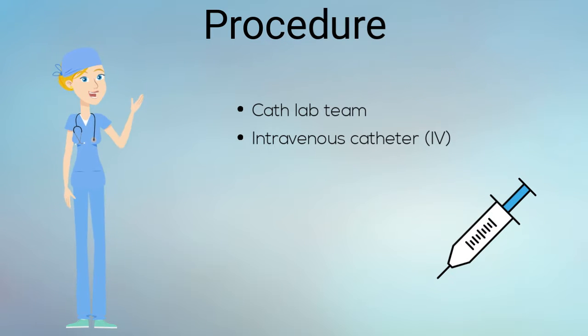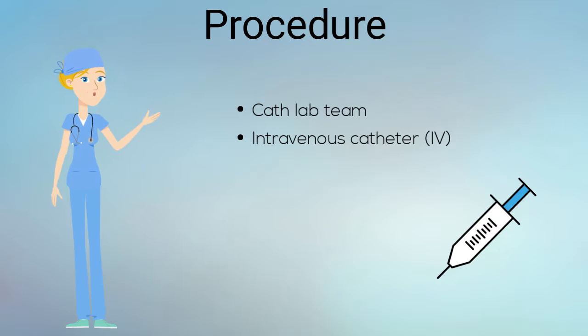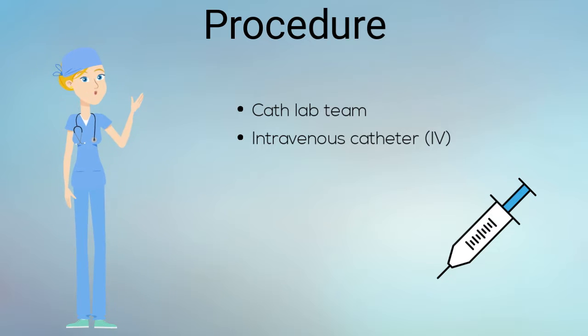On the day of the catheterization, there will be a team of doctors, nurses, and technicians that will help you throughout the procedure. Prior to starting the procedure, an intravenous catheter, or IV, will be inserted to administer medication during your catheterization. This medication will help you feel relaxed but remain awake throughout the procedure.